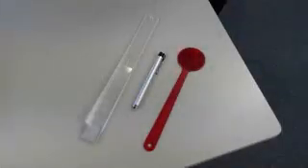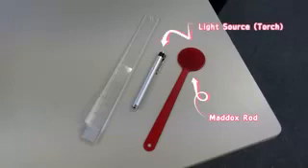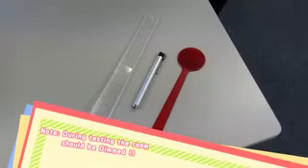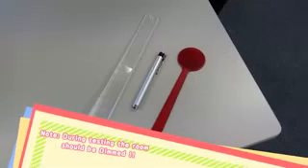Equipment required in Maddox Rod testing are a Maddox Rod, a light source for near and distance, and base in, base out, base up, base down prisms. Note, during testing, the room should be dimmed, however, due to the circumstances, the light will be on.